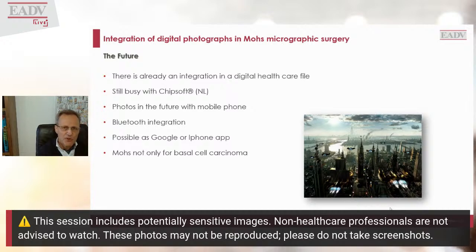The photos in the future will be taken maybe by a mobile phone, and we will have a much smoother operation with Bluetooth integration. Maybe in the future it's also possible to have it as a Google or iPhone app.